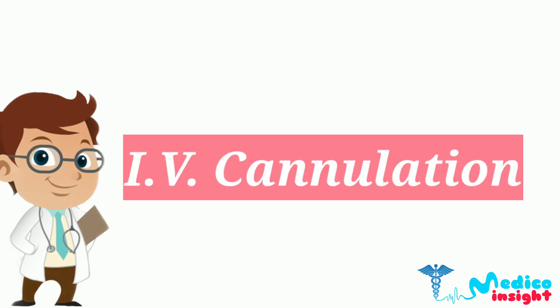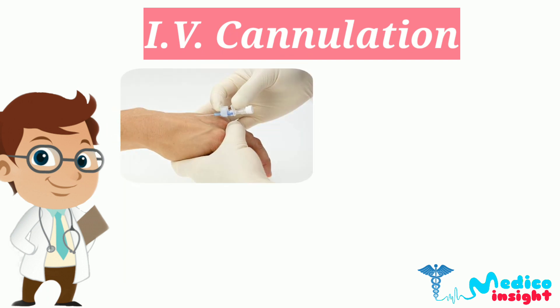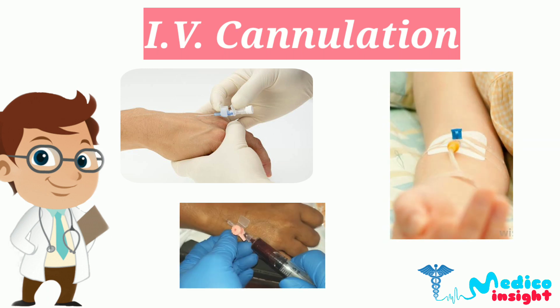Hello everyone, today we are going to demonstrate the proper procedure of IV cannulation. As we know, it is a technique in which a cannula is placed inside a vein to provide venous access. It allows fluid administration, blood sampling, and more.